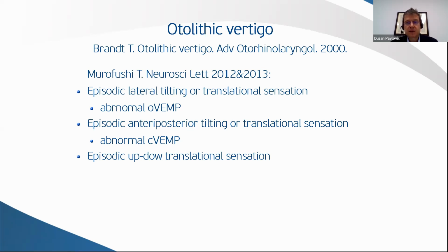He noticed that when a patient has a feeling of lateral tilting, that means the patient has a feeling like the head is tilting in this plane, those patients frequently had abnormal function of the utriculus, abnormal OVEMP. But in patients with anterior-posterior tilting, in this direction, he noticed that most of them had pathological values of CVEMP, that means a not well functioning sacculus.